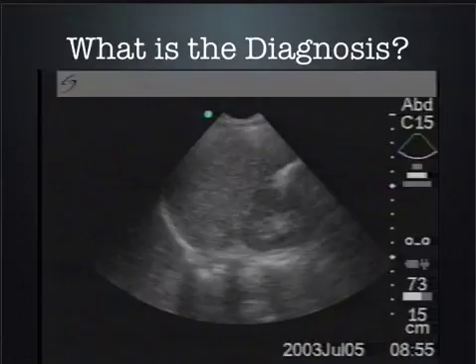And since it's a 1/2 centimeter stripe of fluid, how much blood is that? About a 1/2 liter, so a lot of blood. All right, does that make sense? Don't be confused about size. Little stripes, a lot of blood.